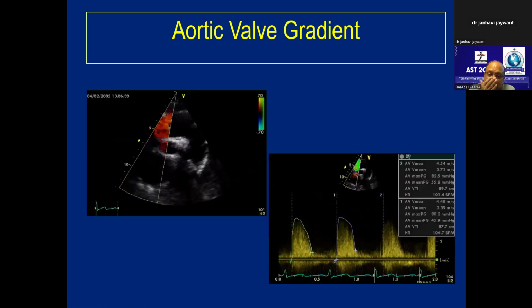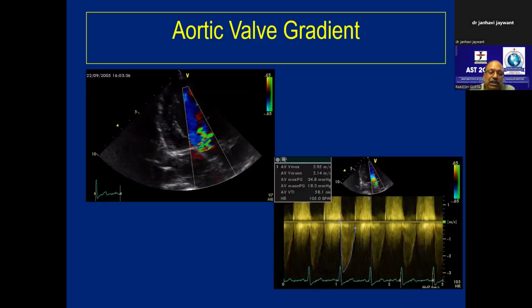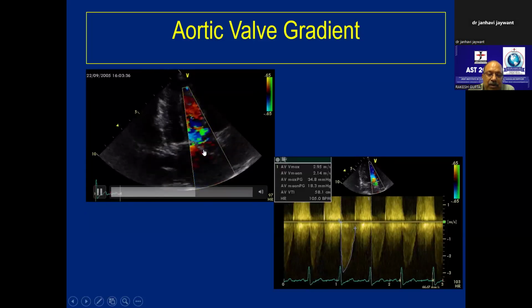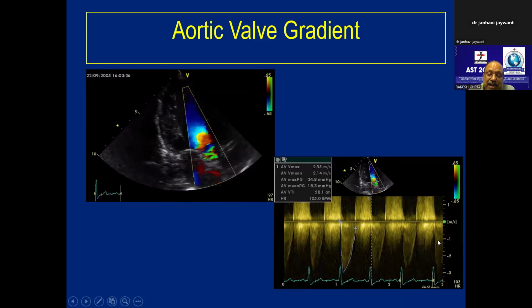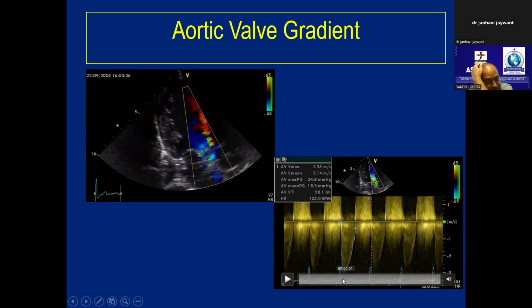When we were teaching the basics, we were saying if you have a stenotic lesion, you are looking for the maximum velocity, so you use continuous wave Doppler. In normal circumstances, whether I keep it at LVOT or at the aortic valve, the velocities will be almost the same. But in aortic stenosis, LVOT velocity will be low, while velocity distal to the aortic valve would be very high. That will not be contained in this Doppler spectrum pattern. By pulse wave, it will produce aliasing. For correcting aliasing, we move the baseline upward so that the Doppler spectrum pattern is contained.